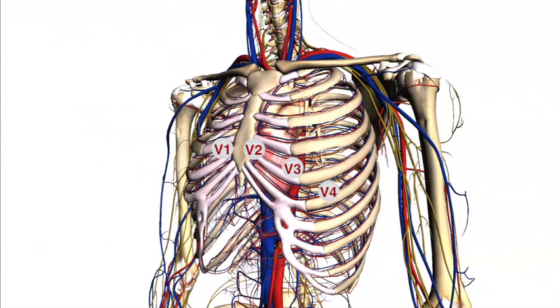For V5, locate the anterior axillary line. The electrode should be placed here on the same horizontal level as V4. For V6, locate the mid-axillary line. The electrode should be placed here on the same horizontal level as V4.